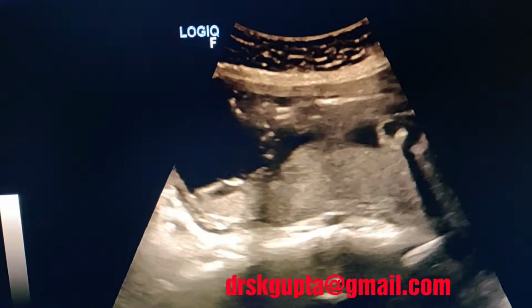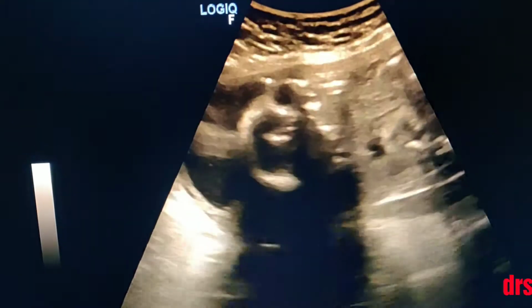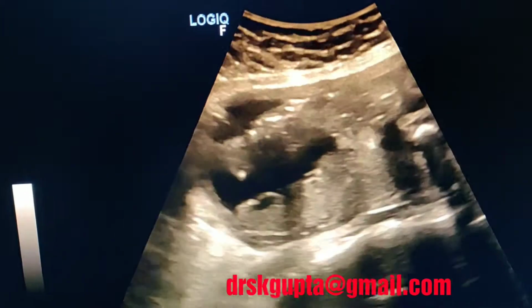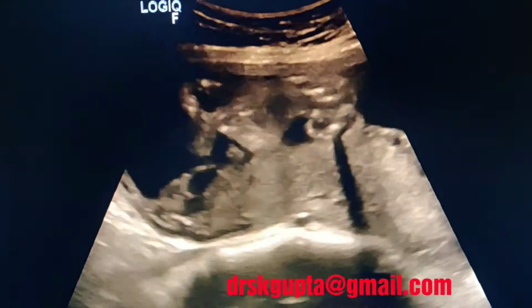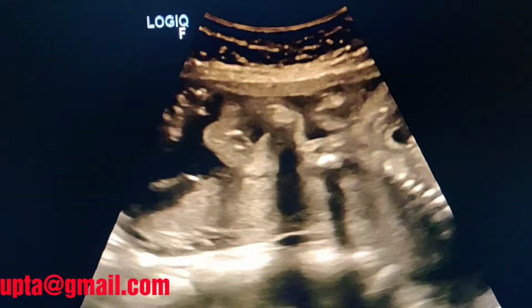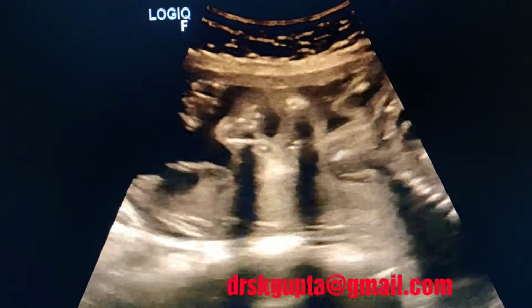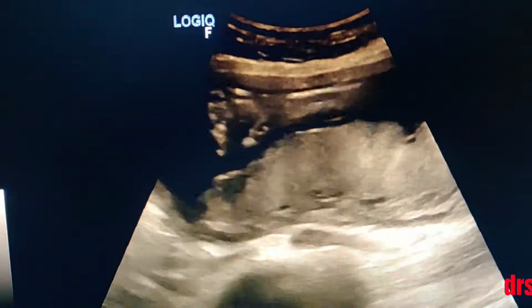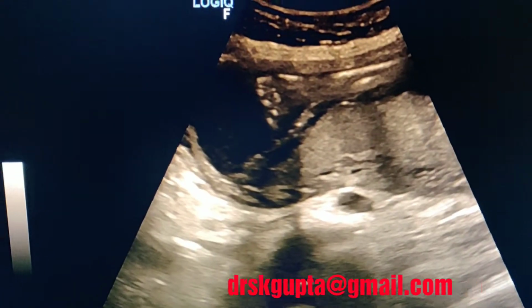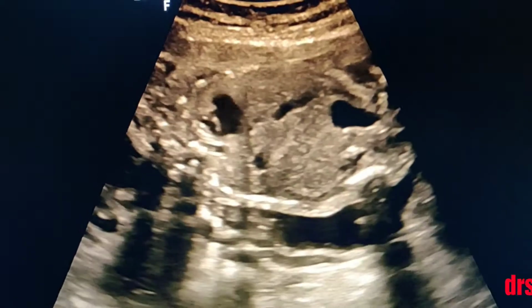Both the hands should be defined. All the effort should be made to see for the limbs. This is the face of the baby, and these are the nostrils. This is the mouth opening. The baby has closed the mouth. This is the coronal section of the abdomen showing the stomach, the heart, and the bladder.